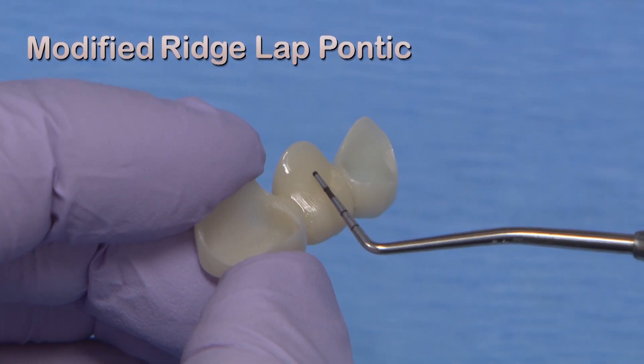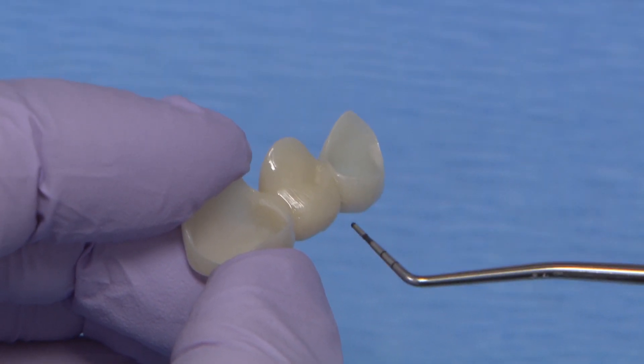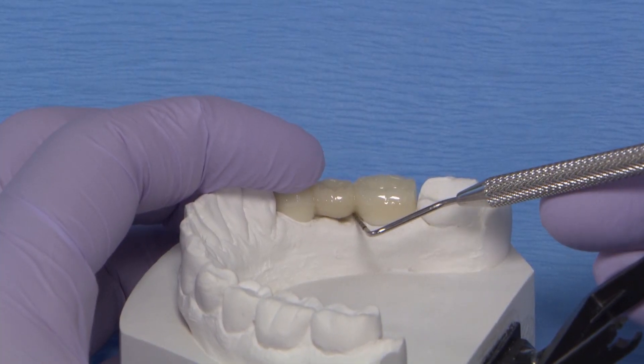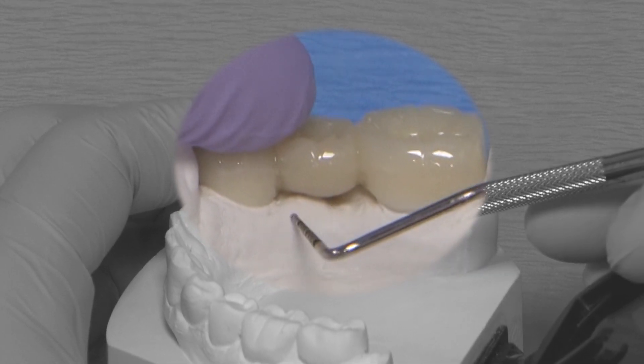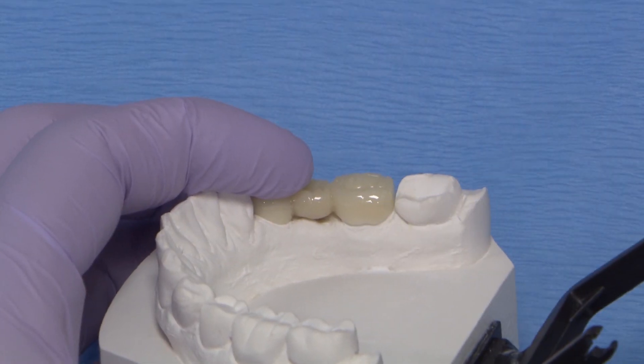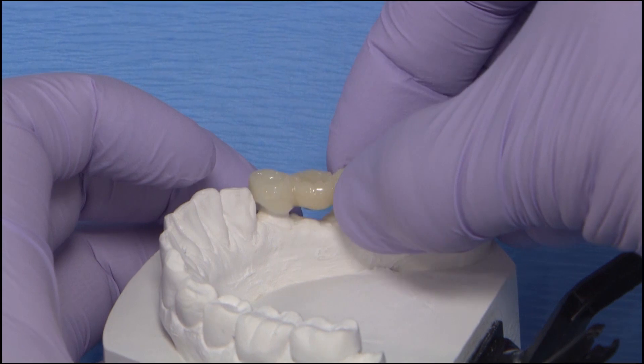This pontic is shaped so that the saddle laps over the buccal side only. The shape and size of the ridge and restoration dictate the lingual design, but it does curve in to leave the lingual ridge exposed. This is fairly aesthetic and more cleansable than the full ridge lap.